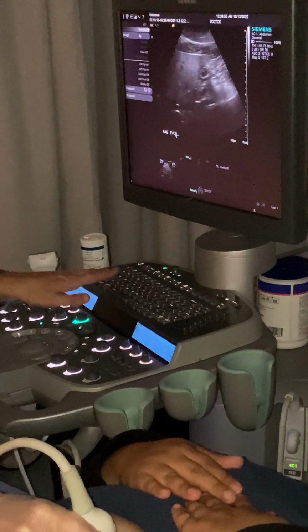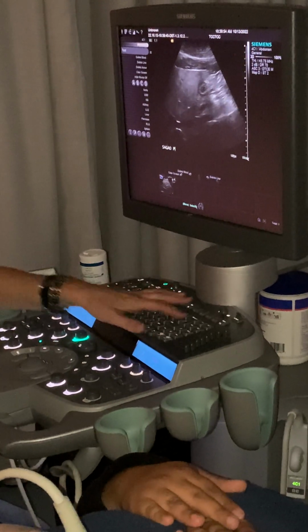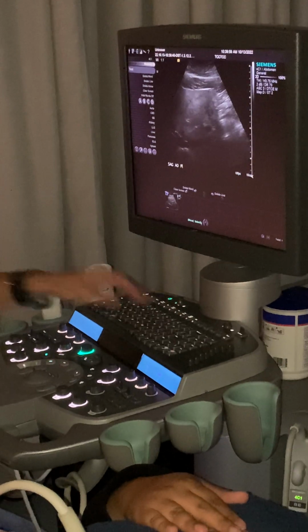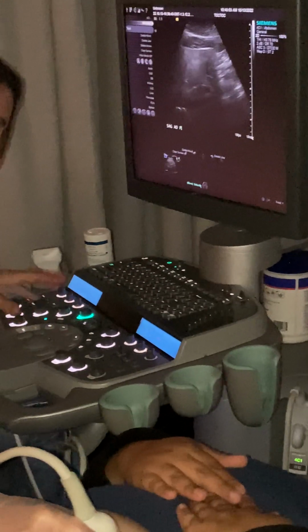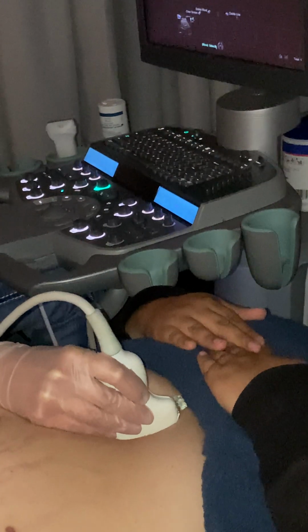Okay, so now we're going to cruise to the aorta, Sag AOP. So we got these machines last year and I haven't worked with them very much. I've taken the summer off, so I do a lot of this.